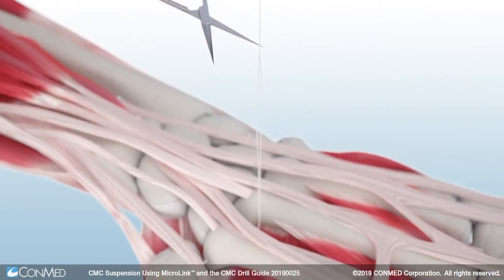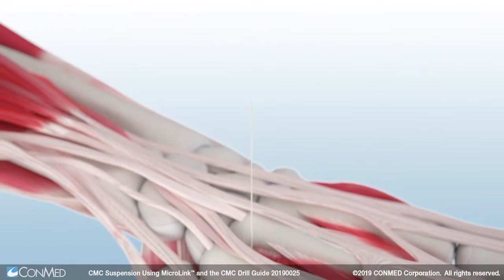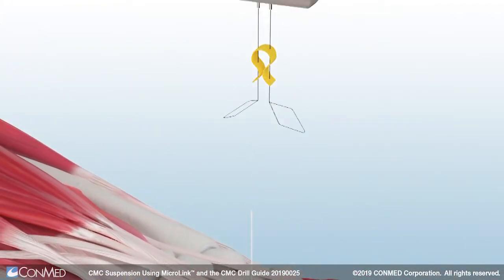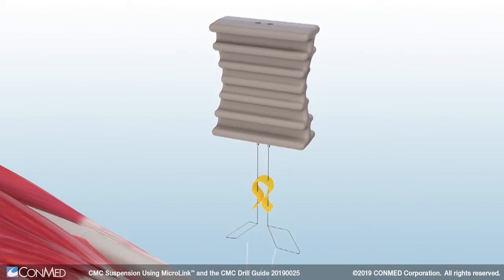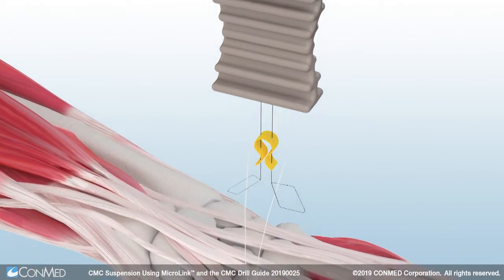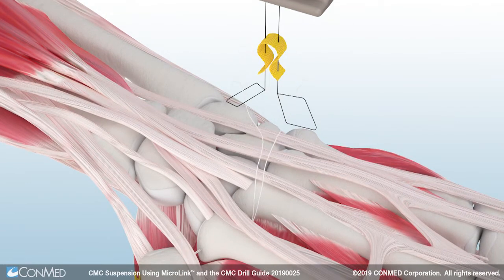Next, cut the proximal end of the splice found on the suture tail protruding from the ulnar aspect of the index metacarpal. To place the backstop, pass at least three centimeters of each number two hi-fi suture tail through the nitinol loops found on the backstop loader.